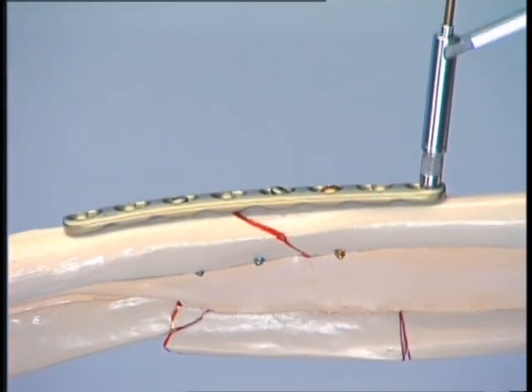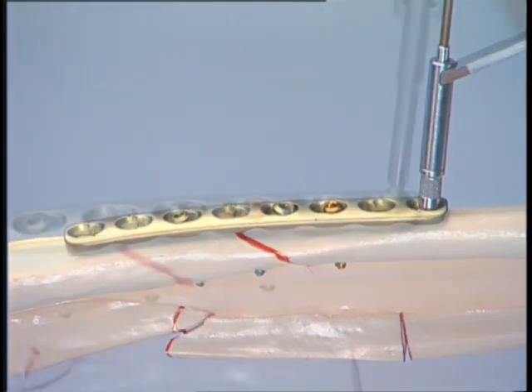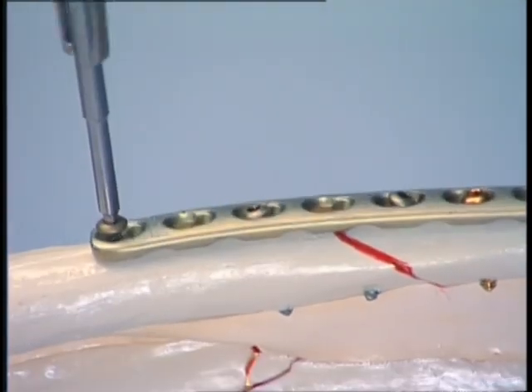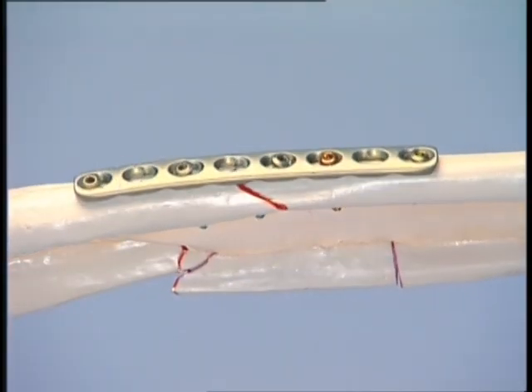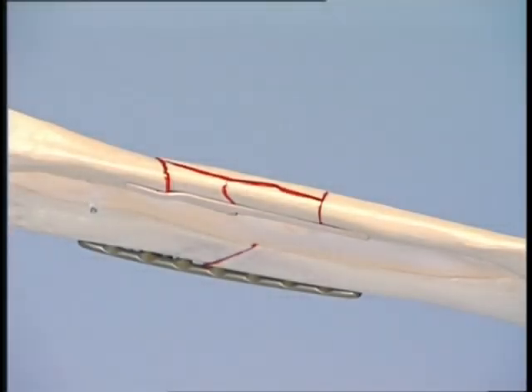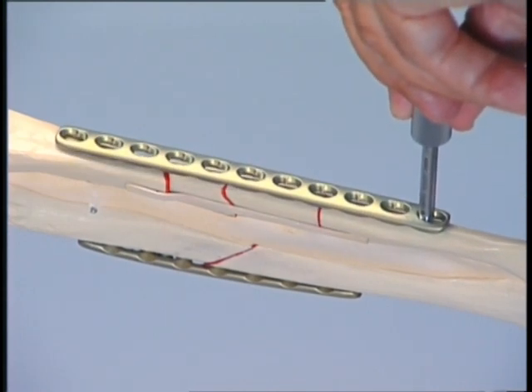To supplement this fixation, another 3.5 mm cortex screw is added at either end of the plate. The five screws should provide sufficient stability in normal bone, although in the case of poor bone, all the plate holes apart from the hole over the fracture should be filled. The next step is the stabilization of the complex fracture of the ulna, using the bridging internal fixator technique with an 11-hole 3.5 LCP.